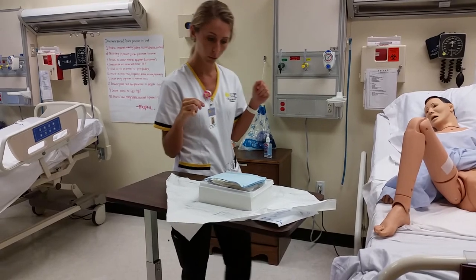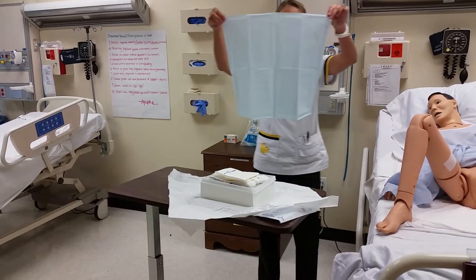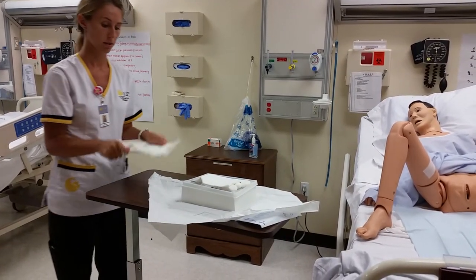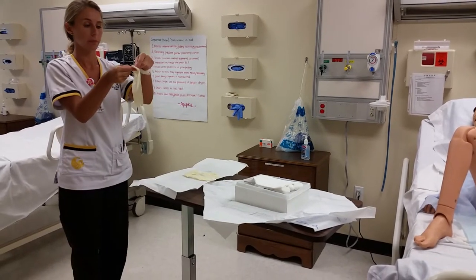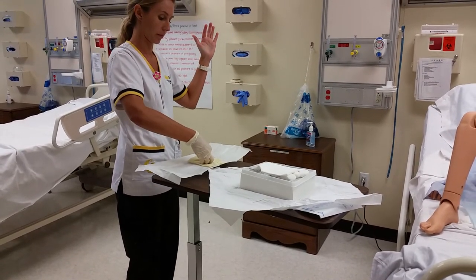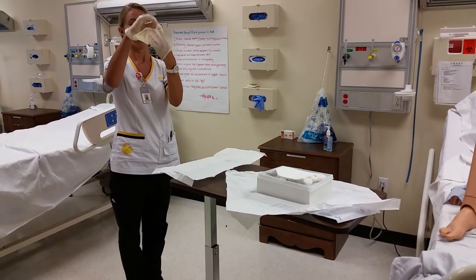So I'm going to go ahead and find my corner. Just right here. And we are going to be placing the shiny side down. We're going to be very careful to not touch our patient's legs. Okay, I'm going to go ahead and don my sterile gloves. I can fix this because sterile can touch sterile.